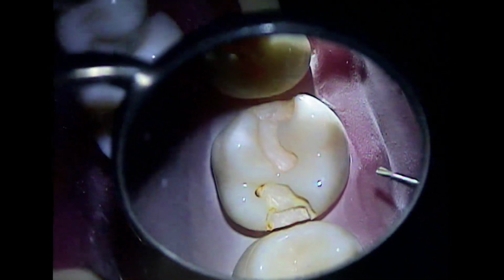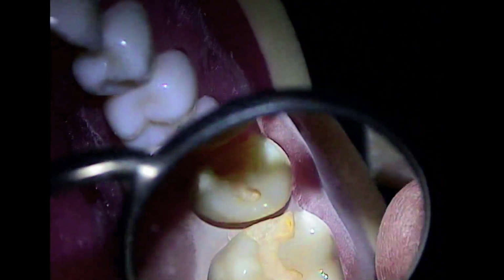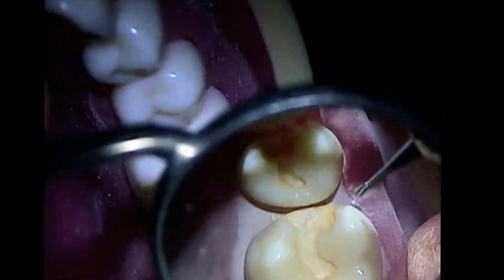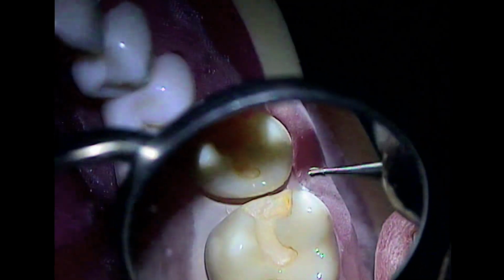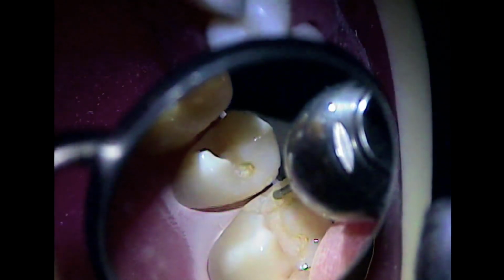Okay. And MO's facial wall, I try to... Yeah, I like your exit angle pretty well. It's fairly flat. Of course, we know it's overextended, but we'll live with that. It's overextended, yeah. But now you came in farther, so now it's easy to put the axial where you want it, which should probably be about right here.